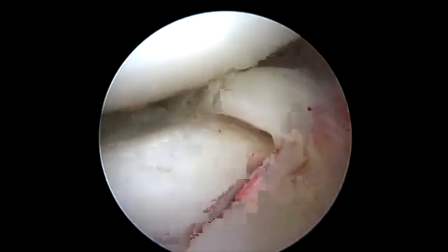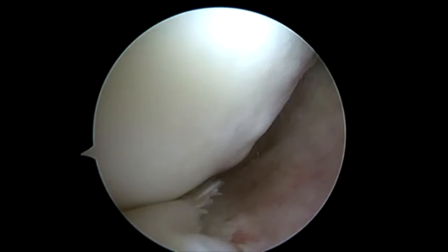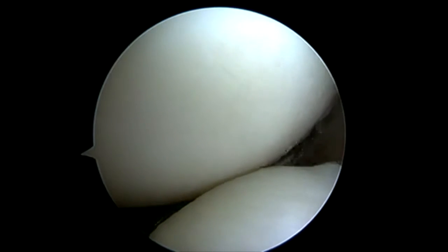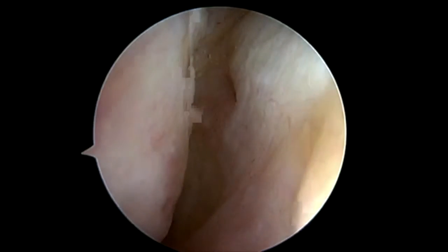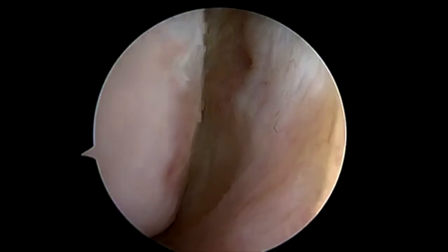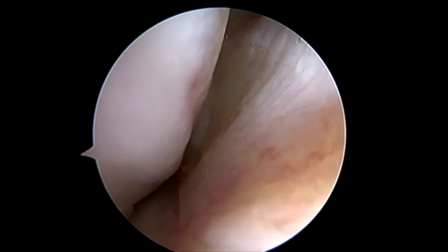We're pretty tight inside this knee, so to give us access I'm going to trephinate my medial collateral ligament. Here I'm just palpating the MCL. I'm going to bring my spinal needle in just above the meniscus and then trephinate the medial collateral ligament as I move up towards the medial epicondyle so that we can gain access to repair this medial meniscus tear.